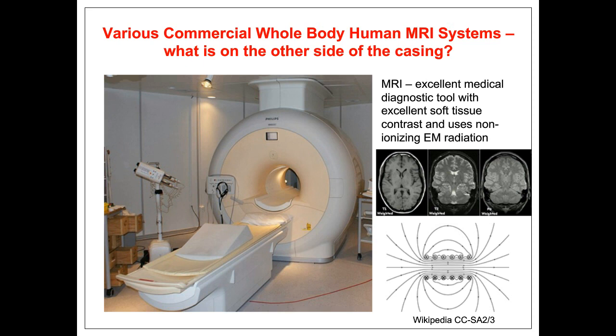Now the image here shows a high field solenoidal magnet that generates a strong static magnetic field that in MRI parlance is called the B0 field. And it's that B0 field that forms the basis for the MR phenomenon. But what's really less clear and actually quite hidden in the image is what's going on behind the nice white clinical looking casing that surrounds the actual magnet itself. This casing hides quite a lot of electronics, very interesting electronics, and some of it is at RF frequencies.